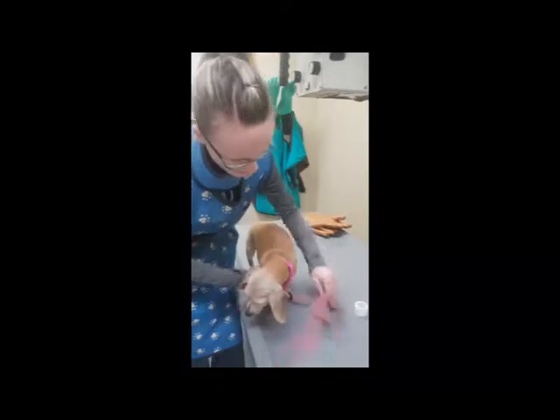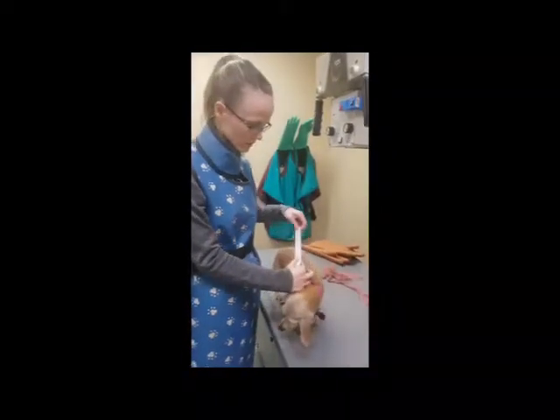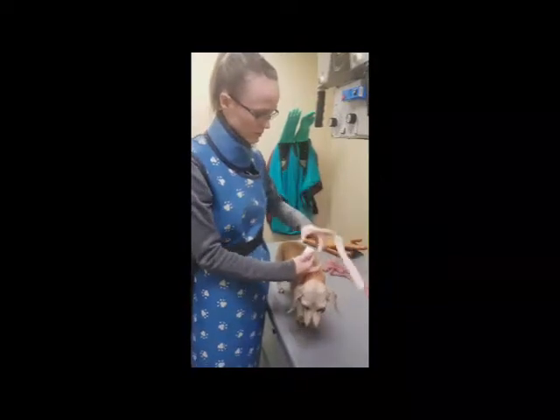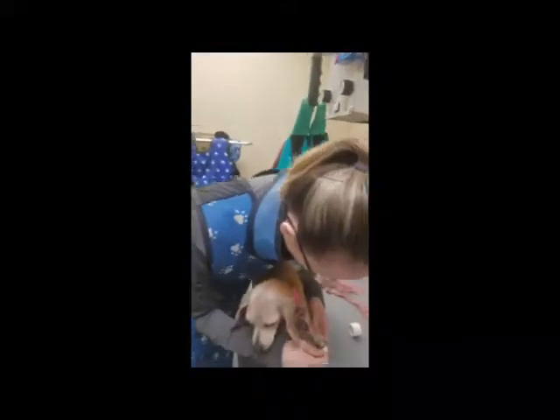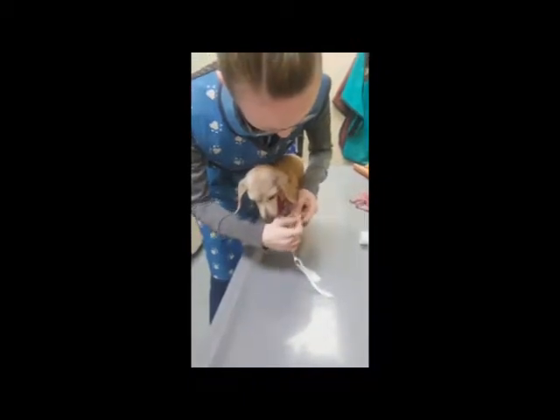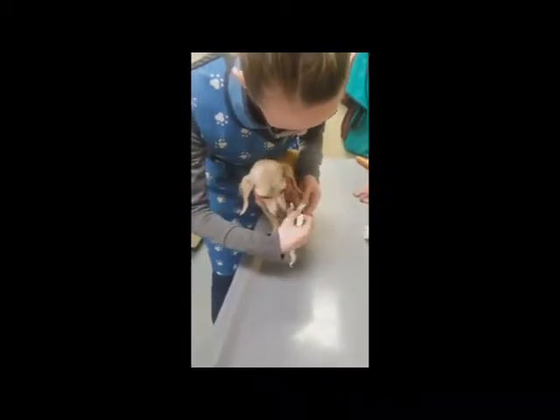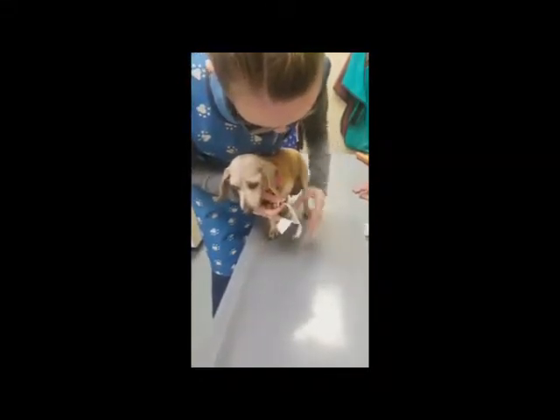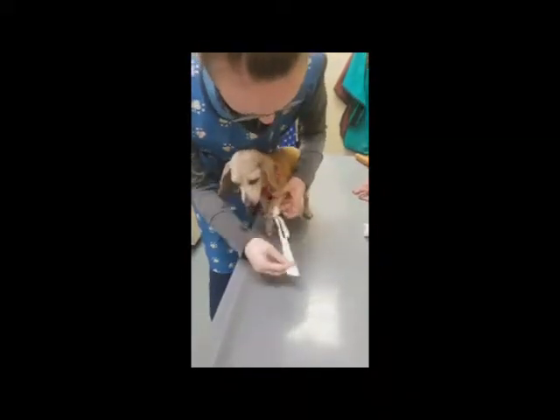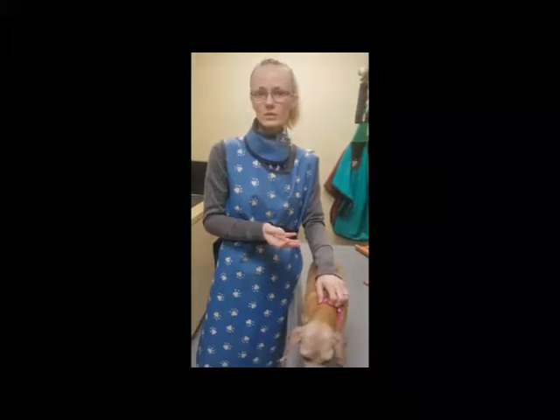Another good tool is tape. For hard images like the phalanges, you take a piece of tape and rip it down the middle. Then you take whichever phalanx is of interest and wrap the tape around it. Her toes are kind of small, but this allows you to pull their toes so your fingers aren't in the picture — because your fingers would impede the image of the bones you want to look at.